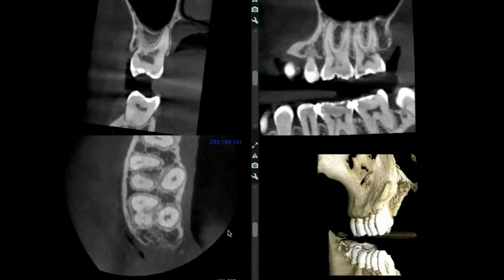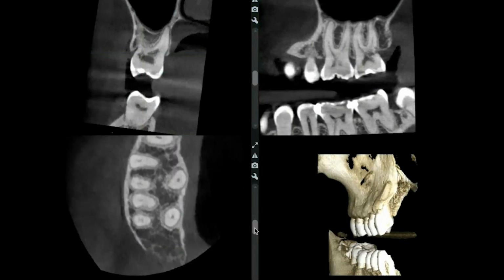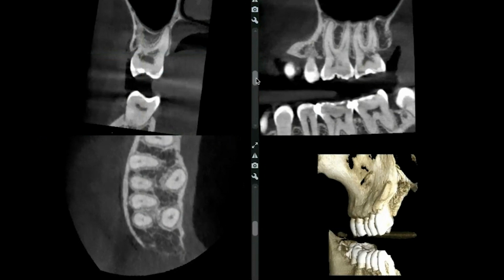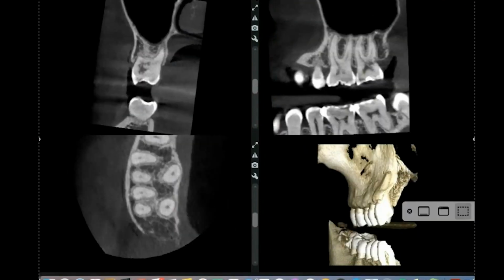Anytime it's past Heithersay class 2, we are very concerned about whether or not it can be treated endodontically. This saves the patient invasive treatment and unnecessary procedures, and it saves you chair time as well. This is why it's a key tool in evaluating these radiographic findings.